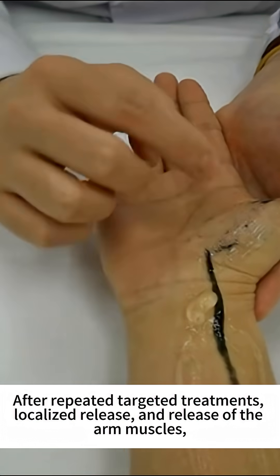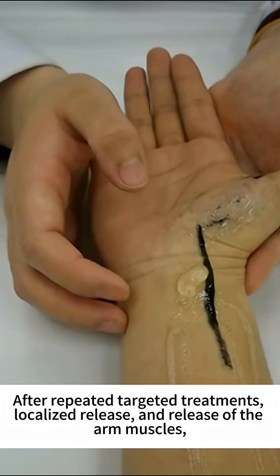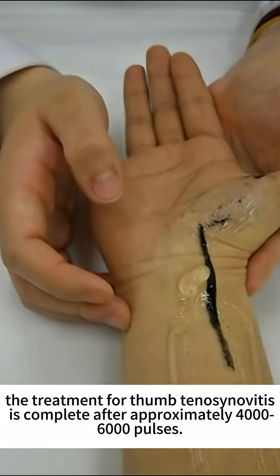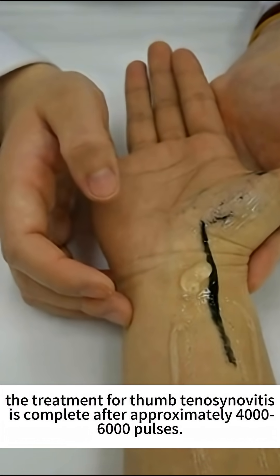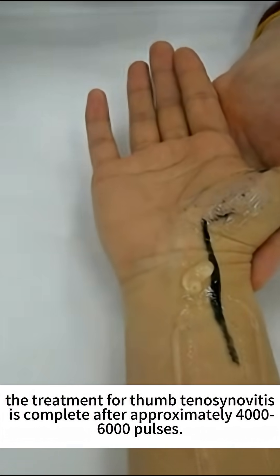After repeated targeted treatments, localized release, and release of the arm muscles, the treatment for thumb tenosynovitis is complete after approximately 4,000 to 6,000 pulses.